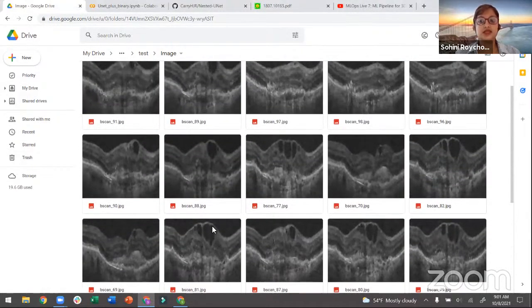Now, working with single shot images, such as if you're doing something like a skin lesion, or if you're looking at the retinal images only, those are just single images per patient. So a different mechanism works for them. But especially when you start having video frames or videos or 3D image stacks, if things are varying in time or space, in this case it is the space, the region is changing, the ML models have to be treated a little differently. So that's the reason why today we are assuming that our starting points are volumetric scans such as this, right?